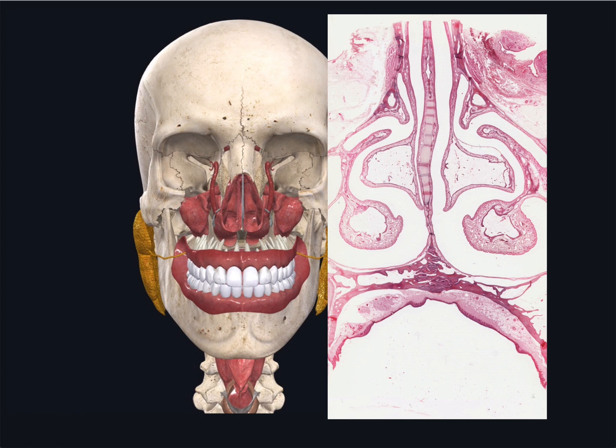Now, in removing this block of tissue, the maxillary sinuses were largely cut away, but their medial walls just remained. These sinuses communicate with the nasal cavity by a small meatus or opening, which is just not visible in this section.